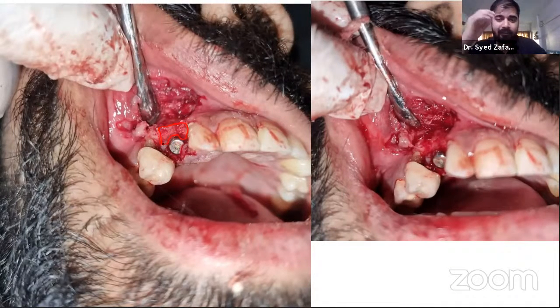But everything comes with something. If you are placing a titanium, you need a second surgical intervention. I have to give the flap, the same flap. The patient will also be traumatized again. And it can also be exposed during the healing process.